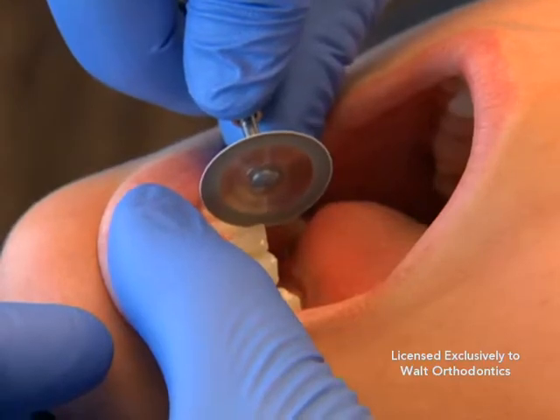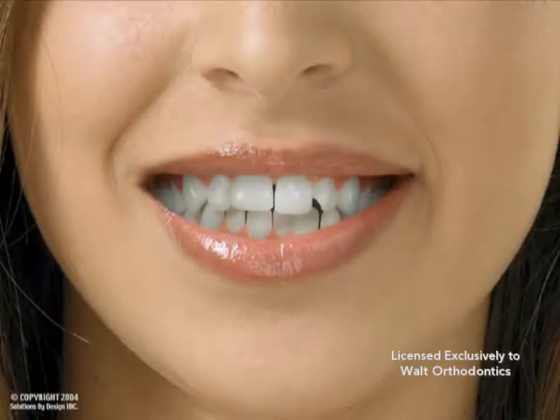Once the tooth or teeth size is reduced, the teeth can be properly aligned with traditional orthodontic techniques.